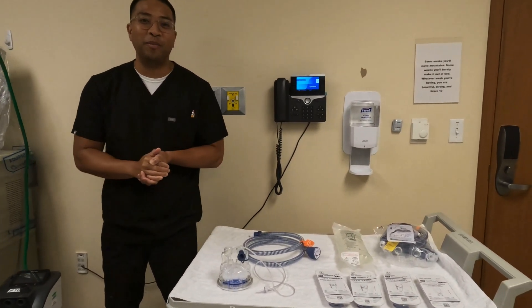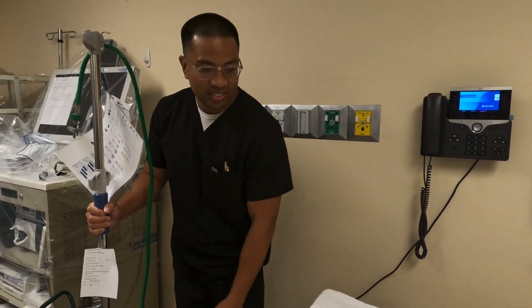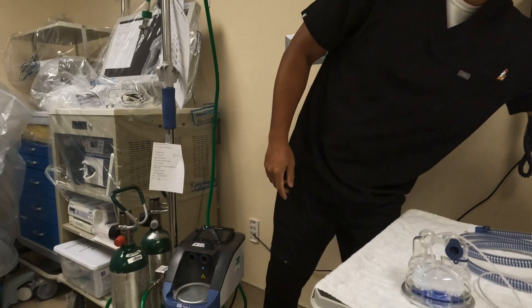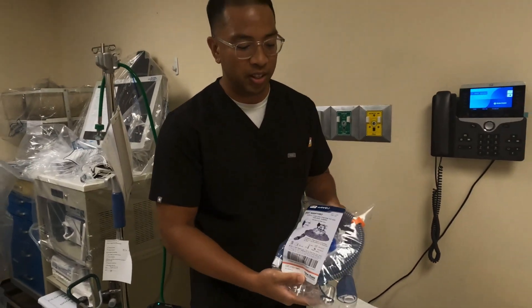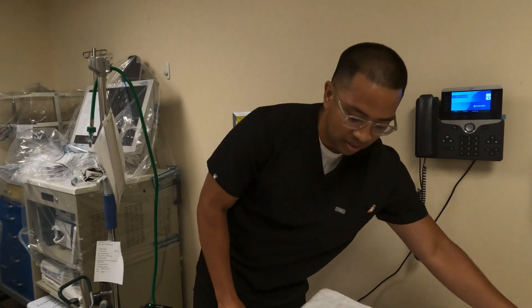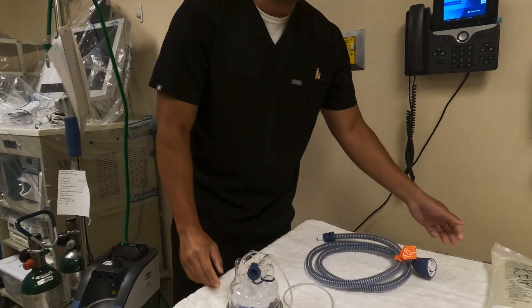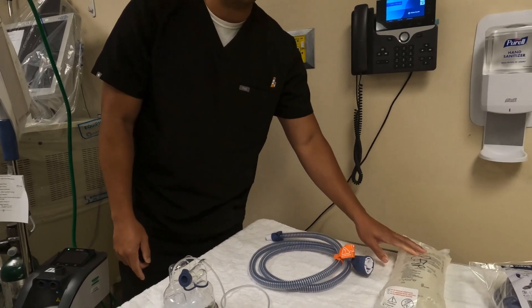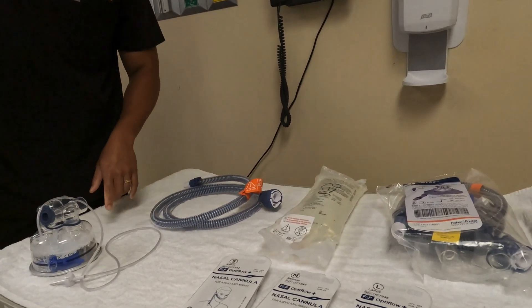First off, let's gather equipment. We need to grab our Airvo3, and also a package which contains our humidifier chamber and breathing circuit, which is also shown here. We'll also grab some water for humidification and then an interface. Today we'll be using the Optiflo Plus.